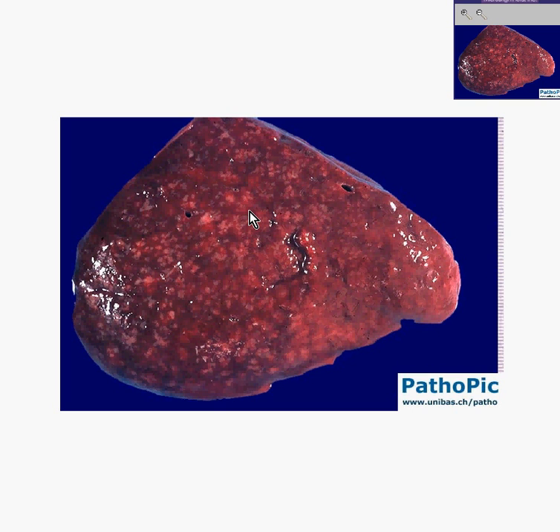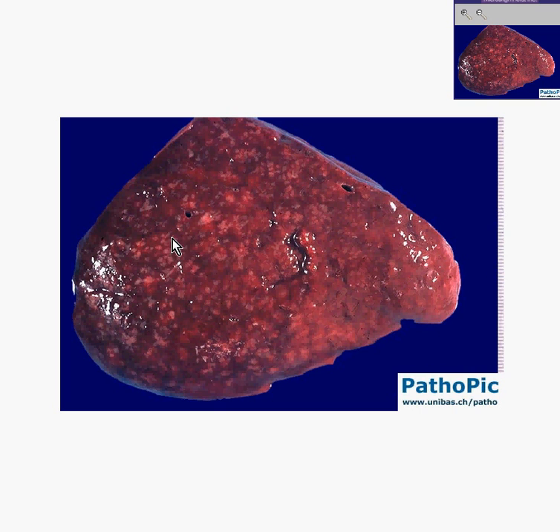Please note that the classical spleen is always described as red pulp and white pulp. The redder areas represent areas where there are more sinusoids — the site of RBC destruction — and the whiter areas generally are the areas surrounding blood vessels, which are more likely to have lymphoid tissue. There are a lot of little white pulp areas here, and some of them are very big, so you might suspect that this spleen has more lymphoid tissue than it should.